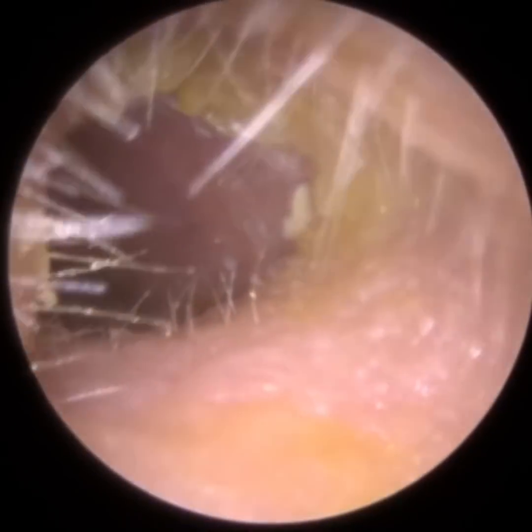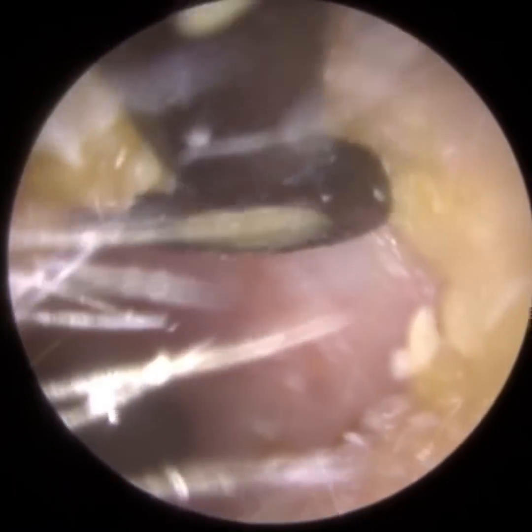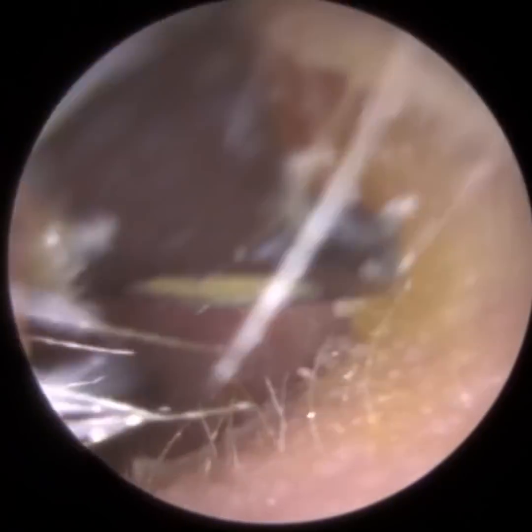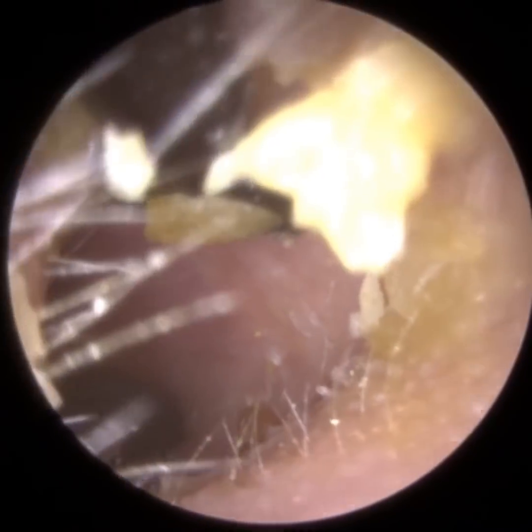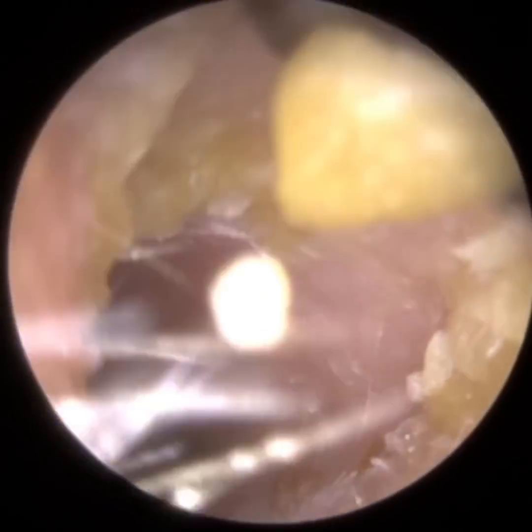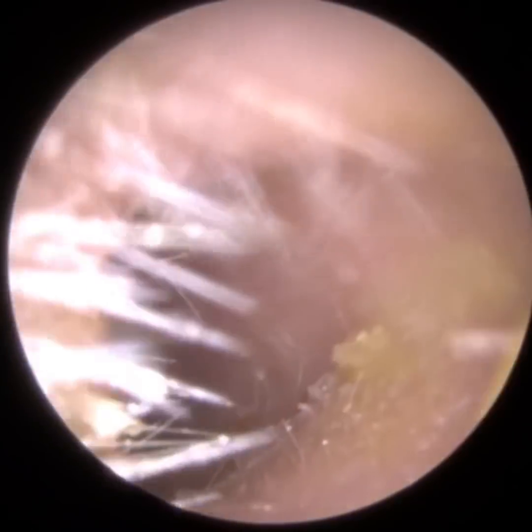Now, if we did this on the bony part of the ear canal, yes, of course, that's going to be really uncomfortable. That's because the inner two thirds of the ear canal, what we call the bony part of the ear canal, is very sensitive. There's no buffer, there's no cartilage or fatty tissue there. It's simply a very thin layer of skin, less than 0.1 millimeters in thickness, and that directly coats and sits on the bone. So there's no buffer there.